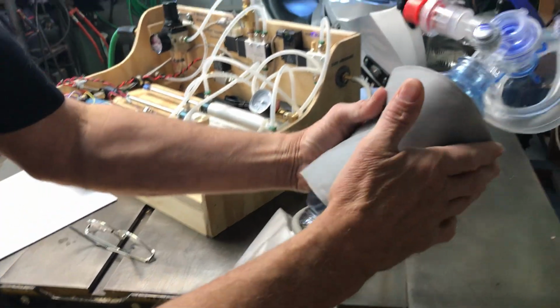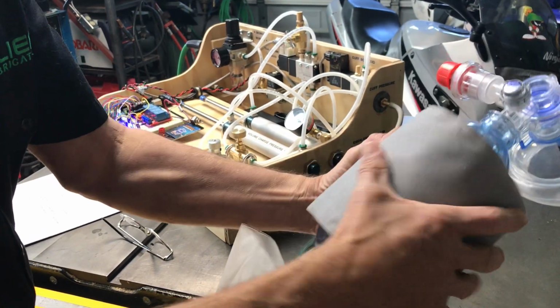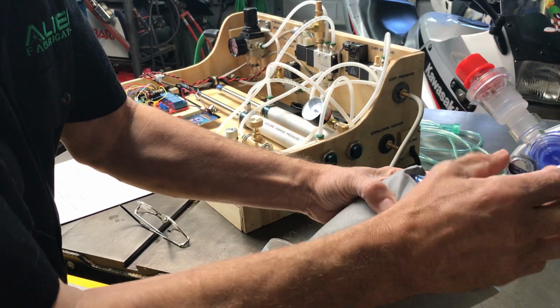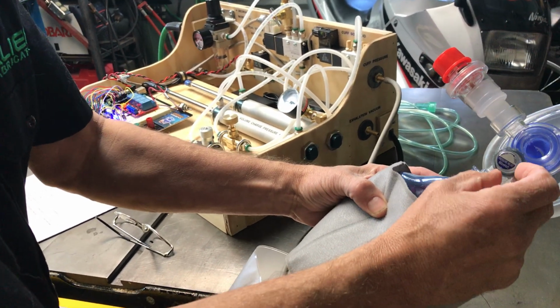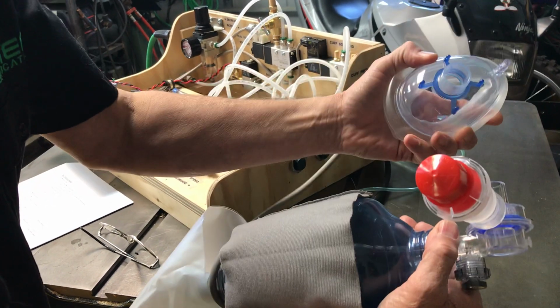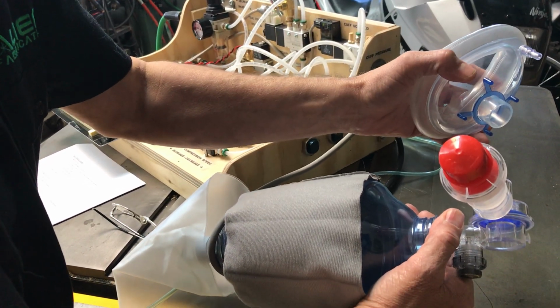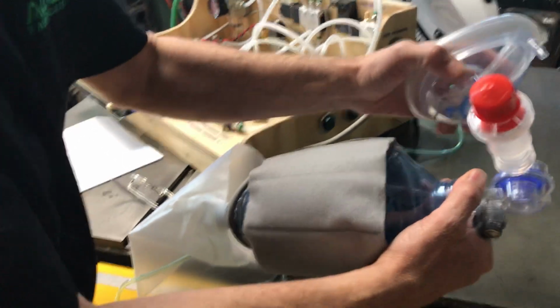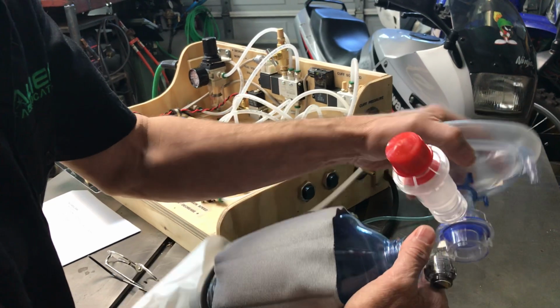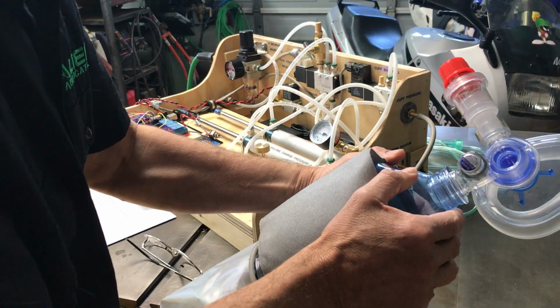Bag valve mask. Air goes in the backside, as well as additional hospital oxygen going in the backside. They mix together before they're delivered to the patient. The bag valve mask has an emergency or safety relief valve built in here, protecting against overpressure, as we talked about. The mask comes off. It can either be used as a mask or with an endotracheal tube into the patient, and the bag valve mask is designed either in the ambulance or in the ER to accommodate either. I just have the mask with me today. David has everything else down in Lexington on the dummy with the endotracheal tube.